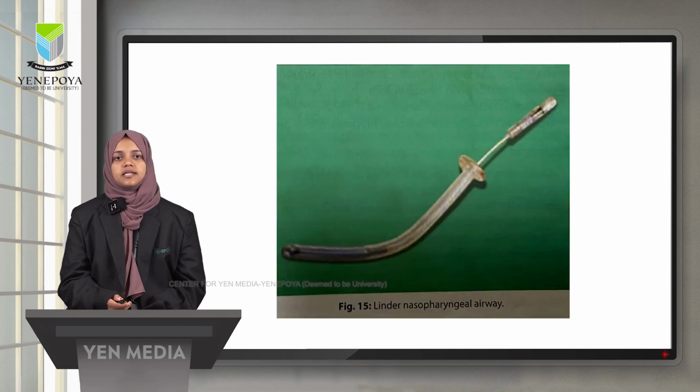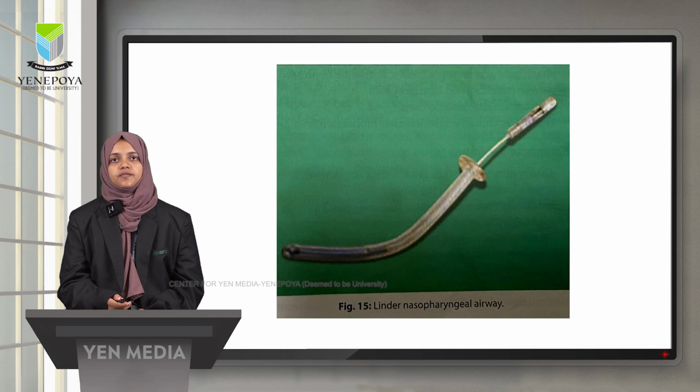This is another type called the Linder nasopharyngeal airway, in which a stylet is used for insertion.